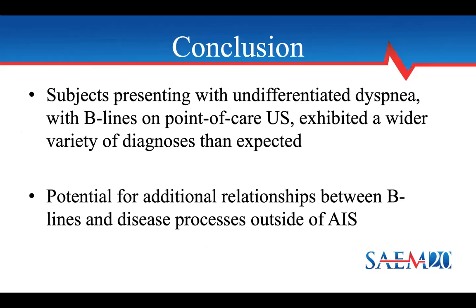While pulmonary edema and congestive heart failure compose the preponderance of patients with dyspnea and B-lines, a wide variety of diagnoses were present. This potential for additional relationships between B-lines and other disease processes requires further investigation.